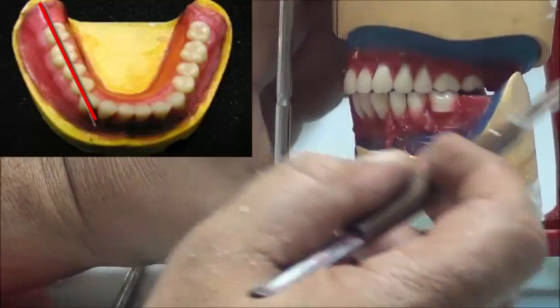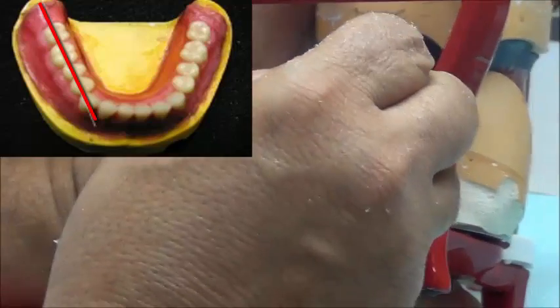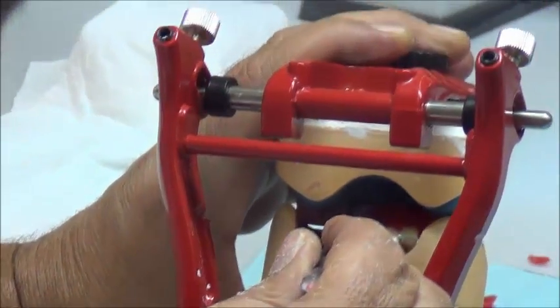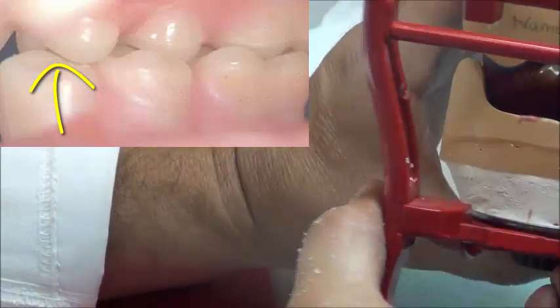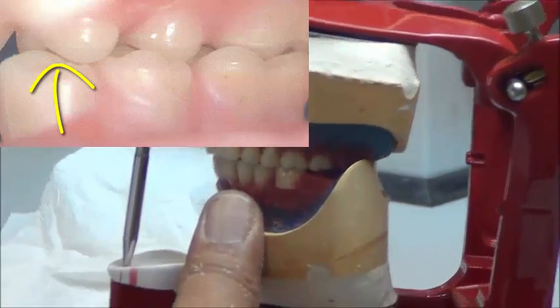And we slightly rotate it to meet the canine. So it meets the canine. In the lingual side, this depends on the morphology of your tooth set. Some teeth sets come with lower 4 without any cusp. You remember that tooth number 4 in natural dentition, the lingual cusp is underdeveloped. It's not like the lower 5.